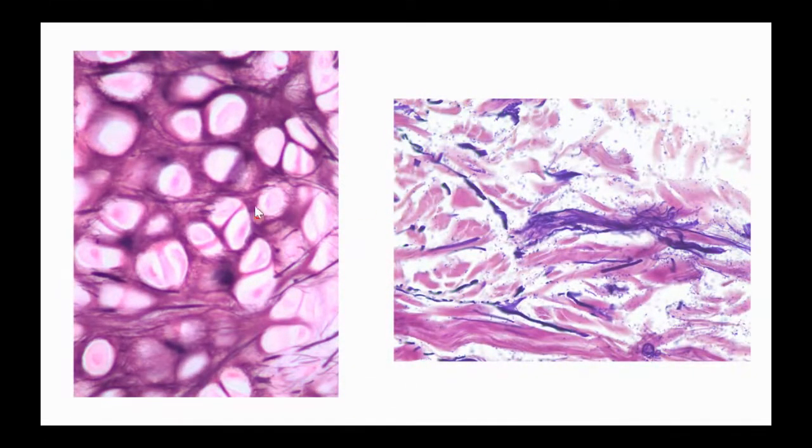Over here, we're looking at those purple proteins with cells mixed in. The cells that I see mixed in here are called chondrocytes. And I'm going to type that in the chat because I don't want to try to write it. Chondrocytes. Yeah, so Audrey's totally right. A lot of times chondrocytes look like deer tracks. So see how they're coming in groups of 2? Chondrocytes like to live together.